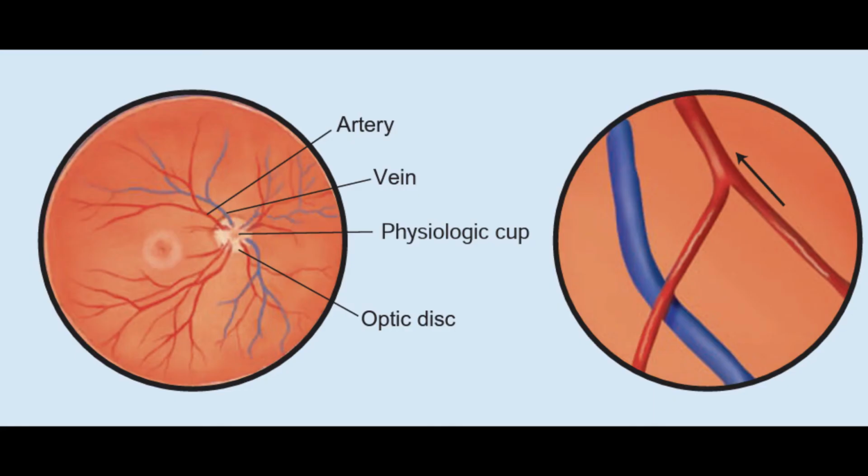Now let us examine the optic disc and retina. First, locate the optic disc. Look for the round, yellowish-orange structure. If you do not see it at first, follow a blood vessel centrally until you do. You can tell which direction is central by noting the angles at which vessels branch. The vessel size becomes progressively larger at each junction as you approach the disc.